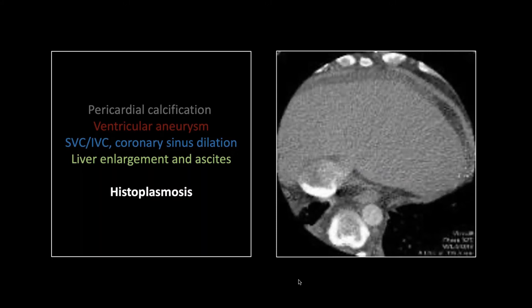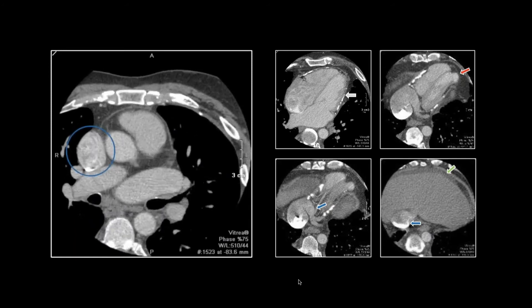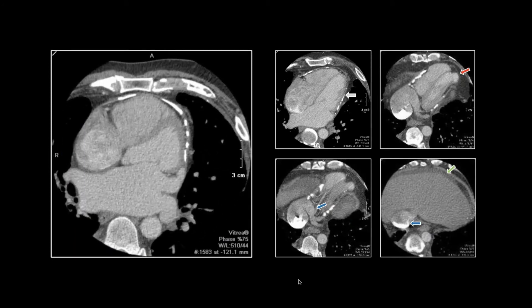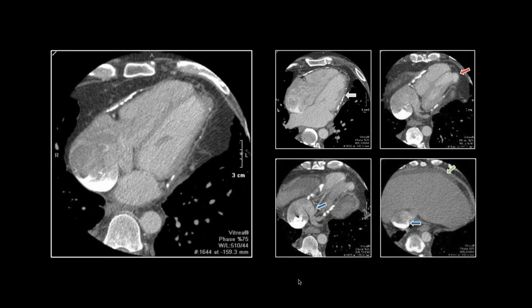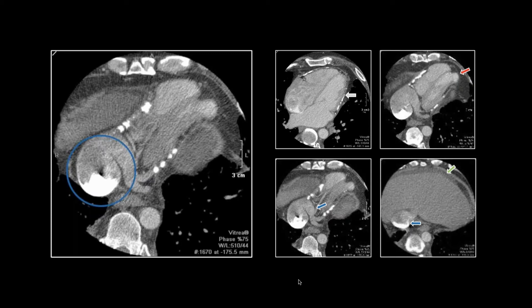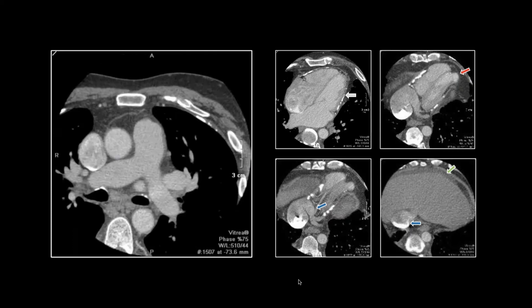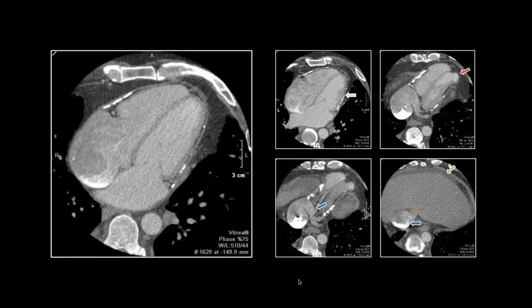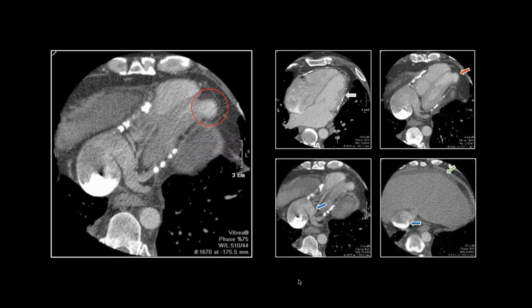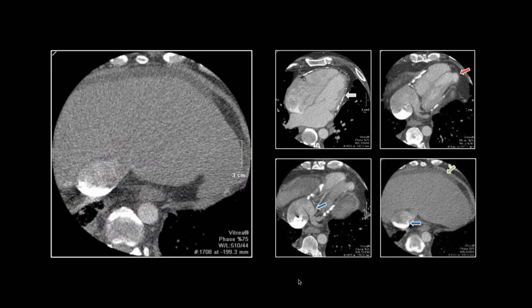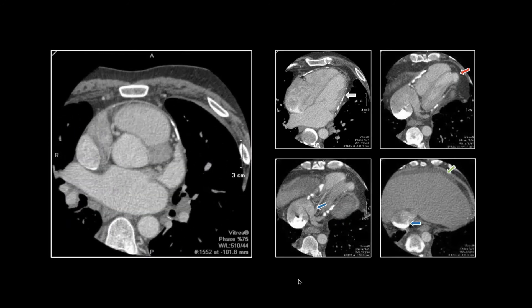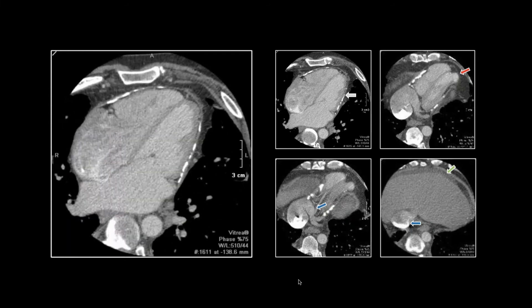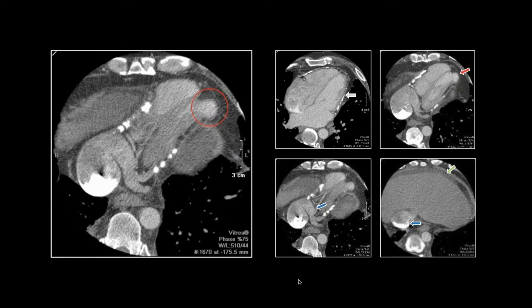Then lastly, there's liver enlargement and ascites and IVC distension — probably developing some chronic passive congestion of the liver related to venous return obstruction. The atria are a little large, the IVC is huge, the coronary sinus enormous, and there's a nodular contour to the liver consistent with chronic passive congestion. There's that little ventricular aneurysm pooching through a tiny pericardial defect. So that is histoplasmosis with calcific pericarditis and a restrictive pericardial physiology.